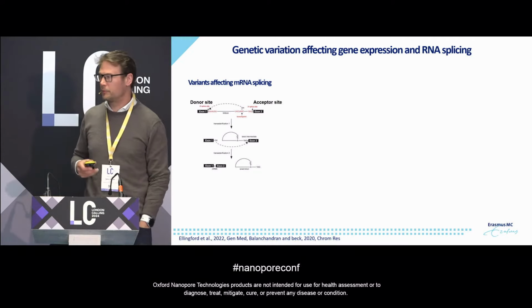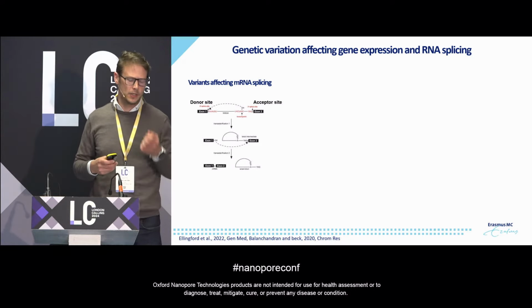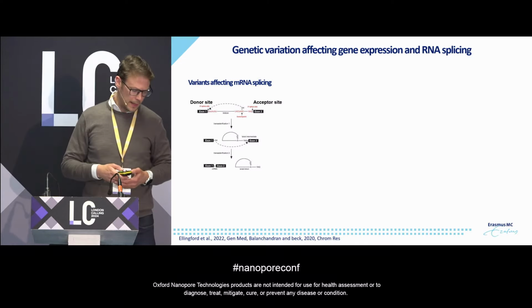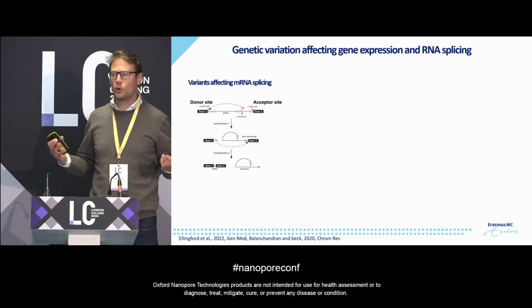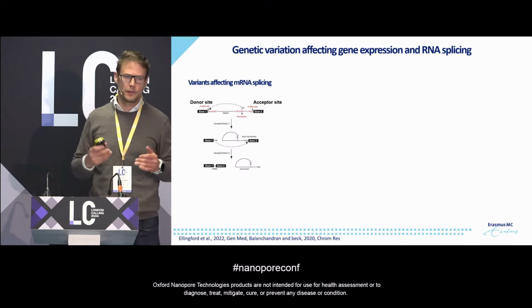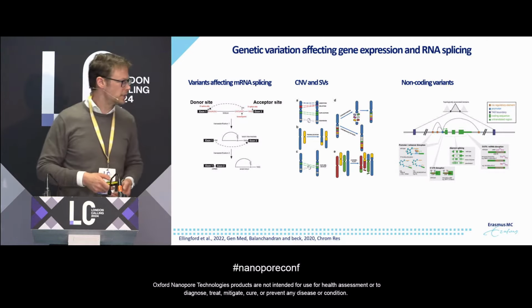As most of you are familiar, genetic disorders can be caused by a variety of types of mutations. And in our diagnostic lab, we typically use exome sequencing. I think our diagnostic yield overall is maybe 50%. So for half of the patients, we typically do not find a mutation. And the reason for that is that there are various different types of mutations.